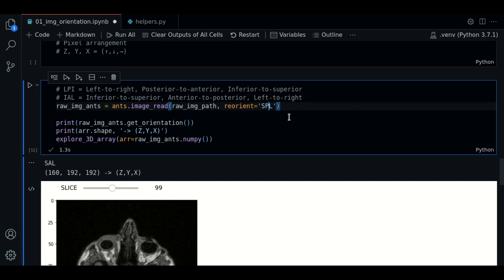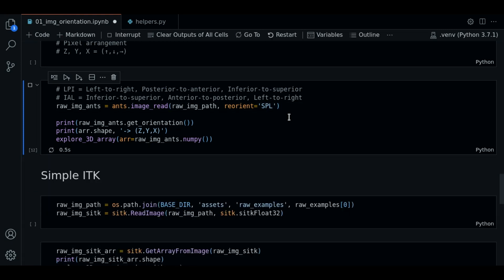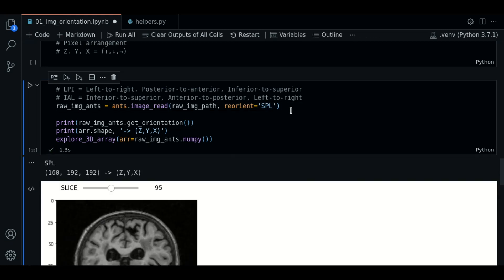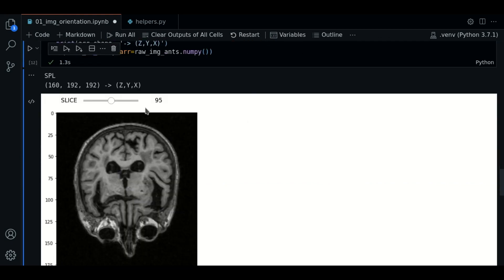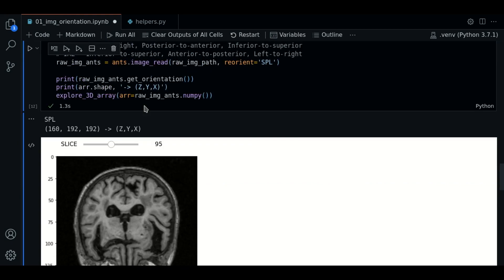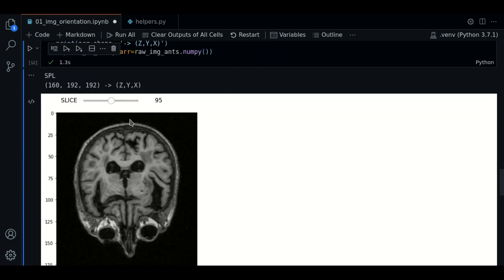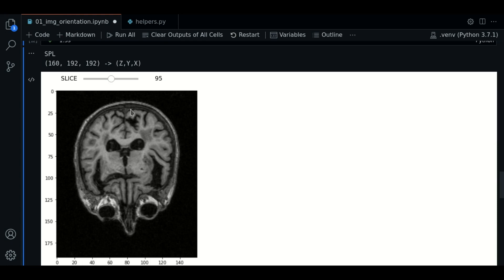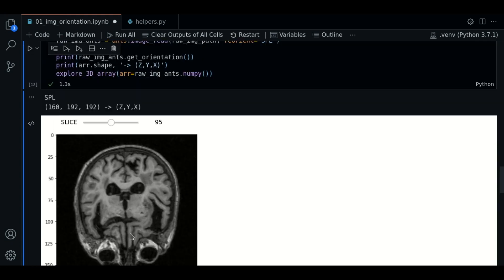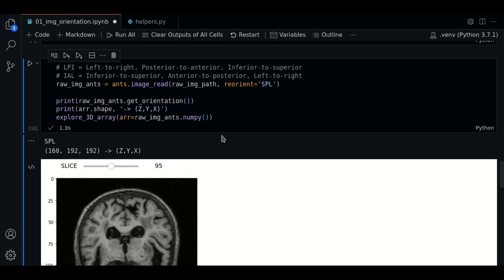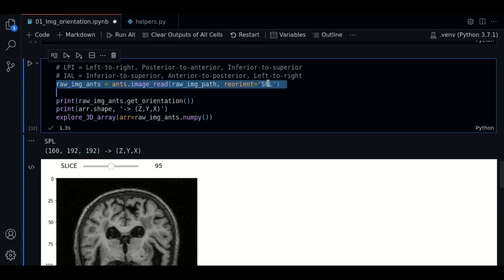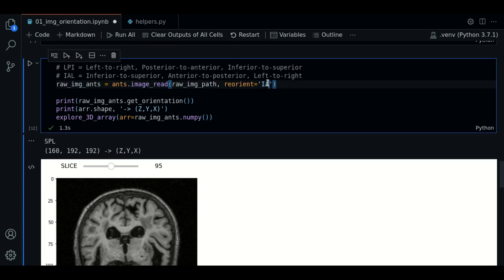For example, a P here. We have now posterior to anterior side. Great. And you can play with different combinations.